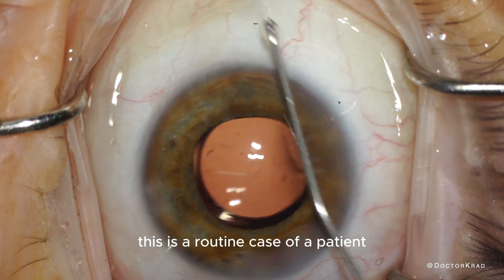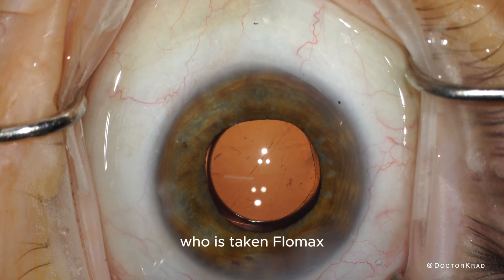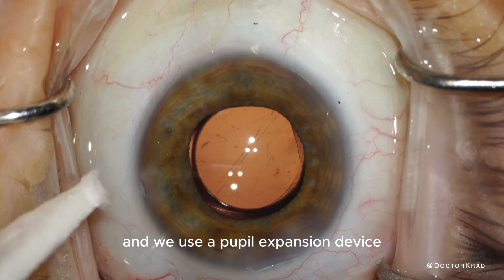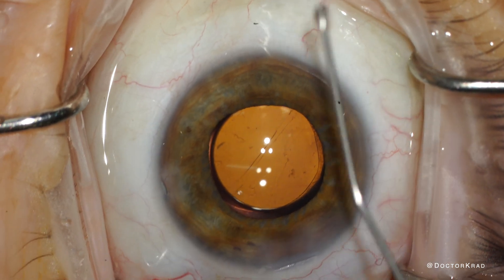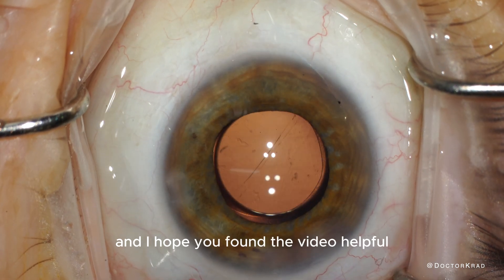After hydrating the incisions to ensure a nice seal, we inject antibiotic in the eye and make sure the eye pressure is appropriate. This is a routine case of a patient taking Flomax — the pupil is small and we use a pupil expansion device, in this case the Malyugin ring, to provide access to the cataract. I hope you found the video helpful. Thank you so much for your attention — I'll catch you on the next one. Peace.